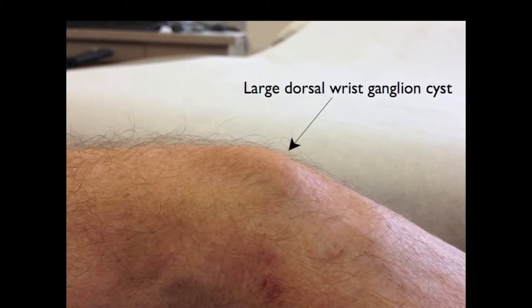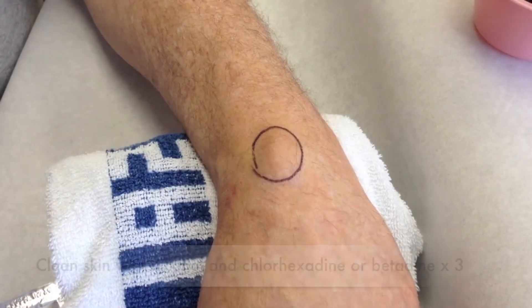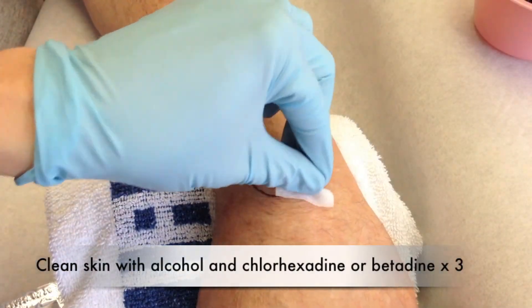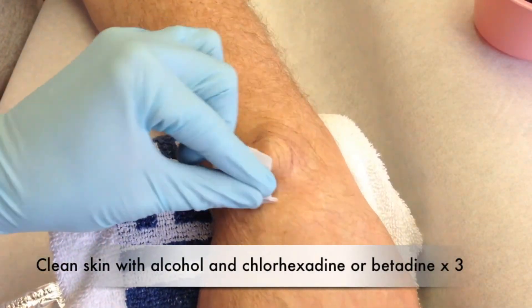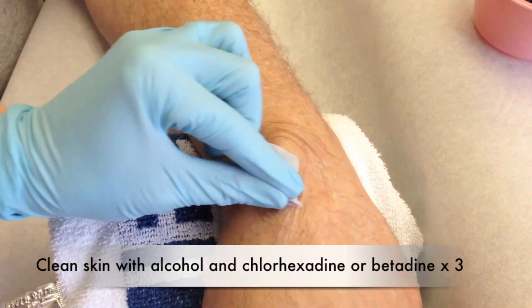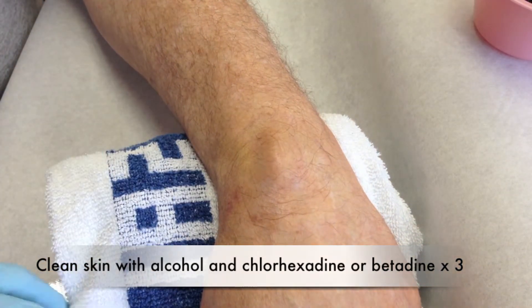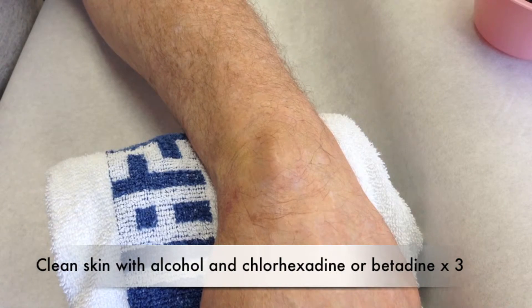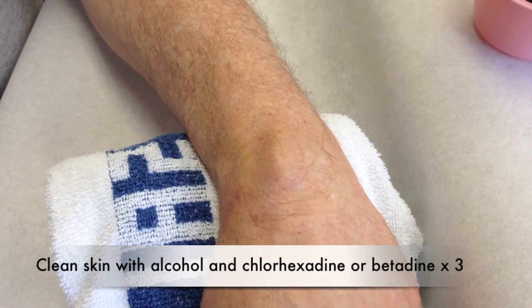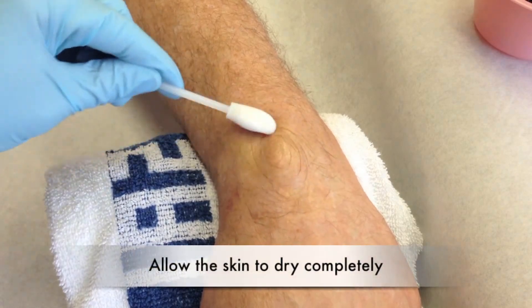In this picture you can see a large dorsal wrist ganglion cyst. The cyst has been marked with a pen so you can see the outline. An alcohol swab and chlorhexidine are used to clean the skin. You should allow the skin to completely dry before proceeding with the procedure.